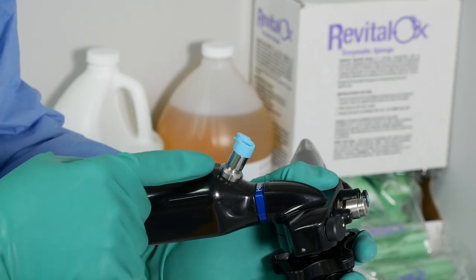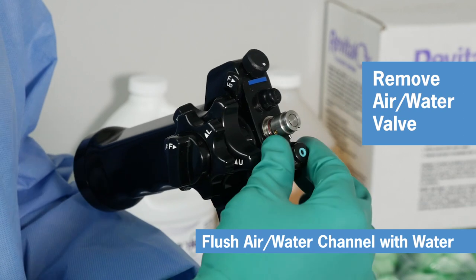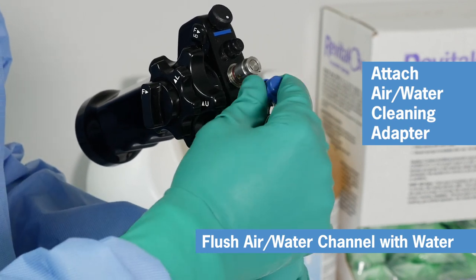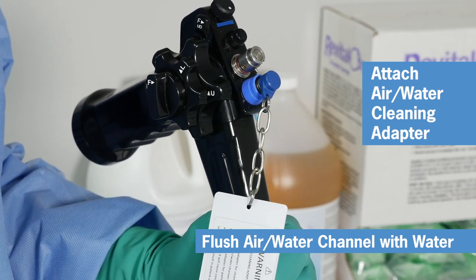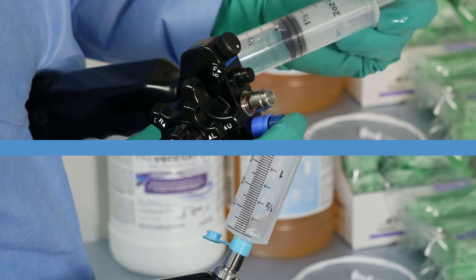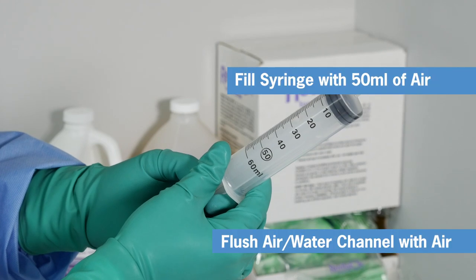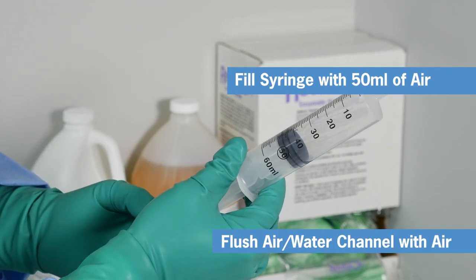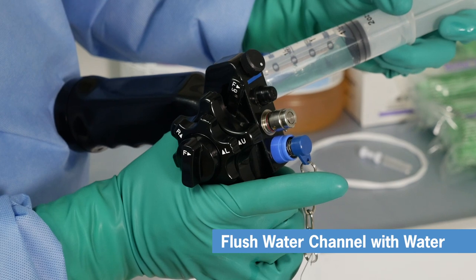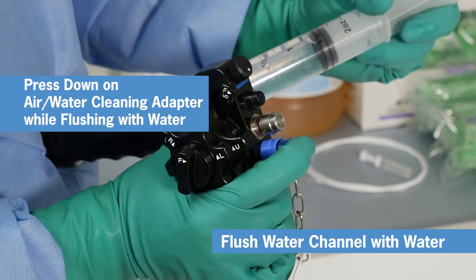Before using the Revitalox products, follow a similar process to flush the air water channel with water. First, remove the air water valve from the control body and replace it with the air water cleaning adapter. Set your valve to the side to wash later. Now flip open the air water inlet cover that we installed at the beginning of pre-cleaning. To flush the air channel, fill the syringe to the 50 milliliter mark and insert the syringe into the air water inlet cover and flush. To flush the water channel, follow the same process while pressing down on the air water cleaning adapter.